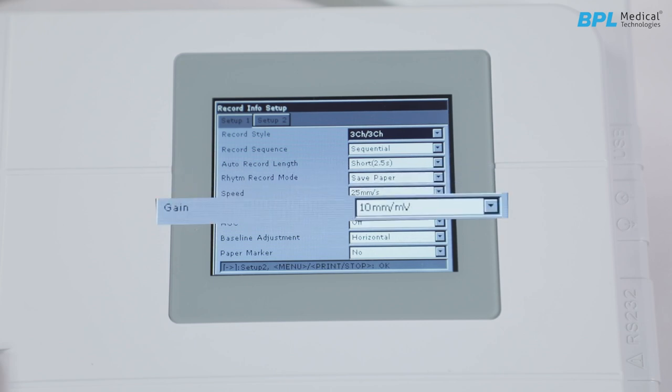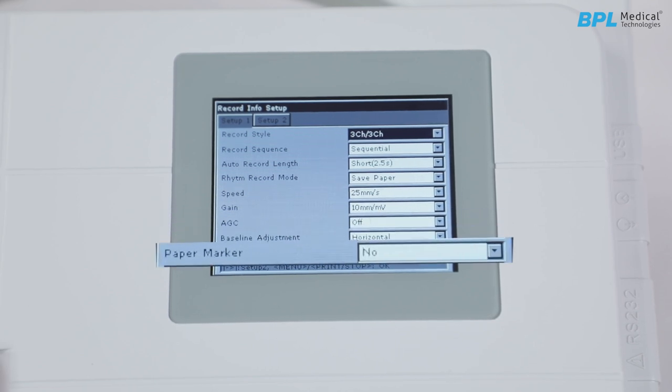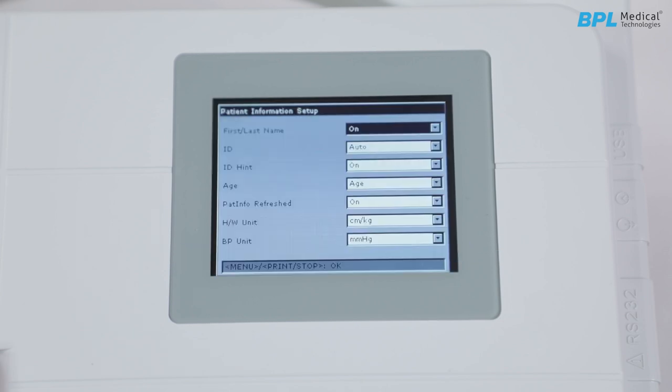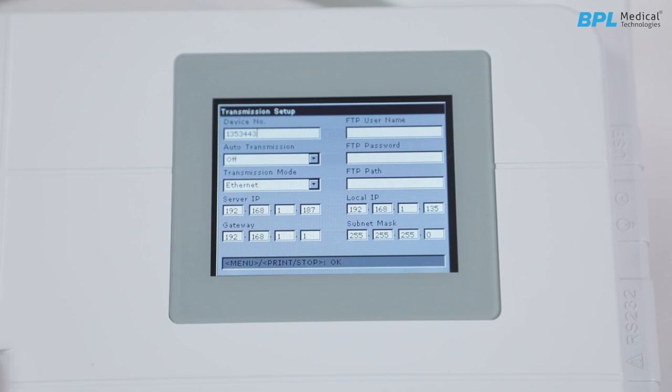Speed and gain — by default gain is 10 mm/mV. AGC can be enabled or disabled. Baseline adjustment and paper marker are also available. Patient info setup allows you to personalize the details required when registering or entering a patient. Transmission setup: ECG data in SCP or DICOM format can be transmitted to a PC through SC1515 software. The server IP needs to be matched for easy data transmission.